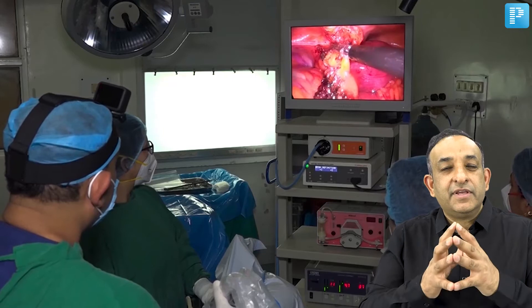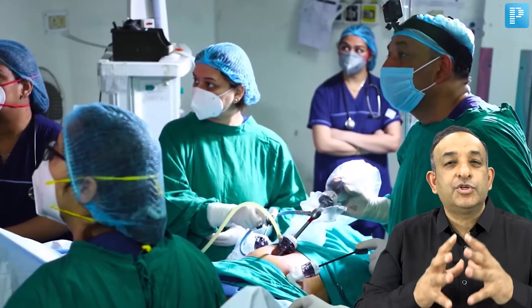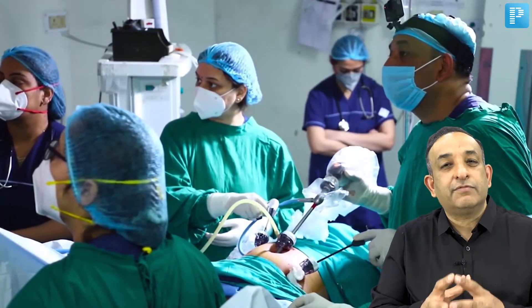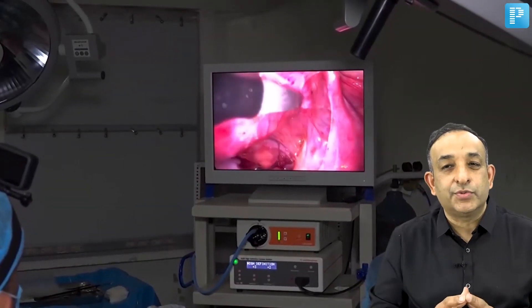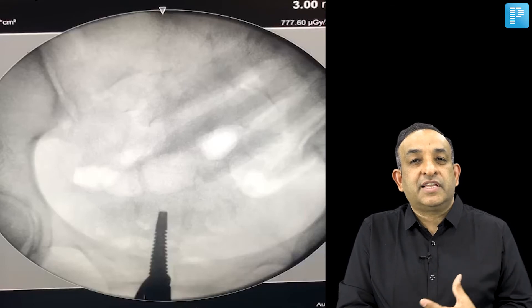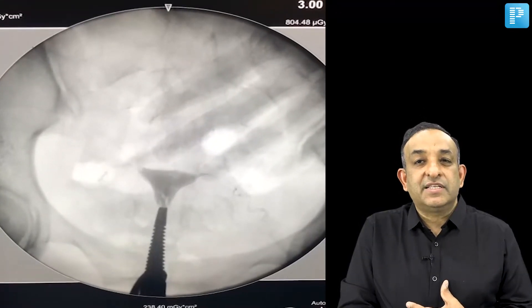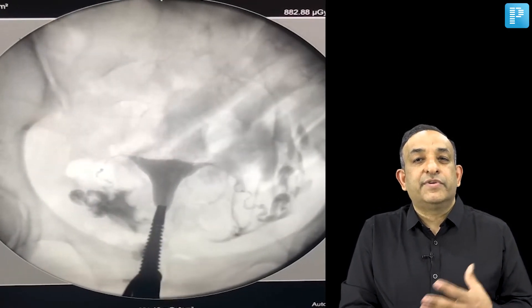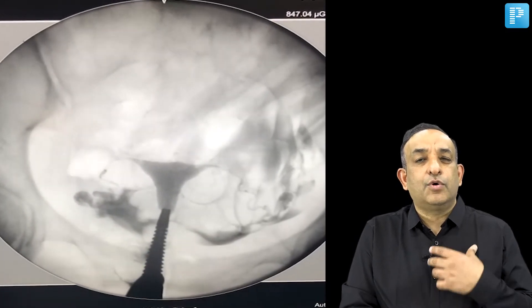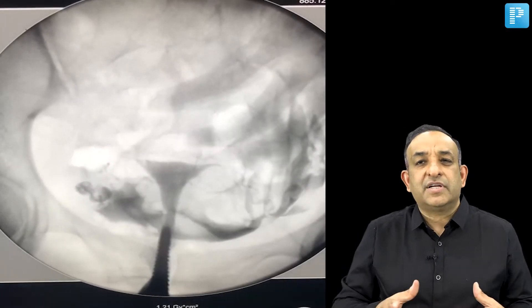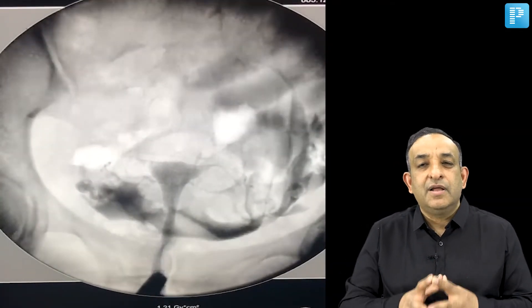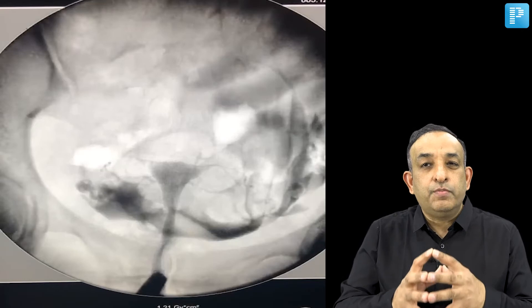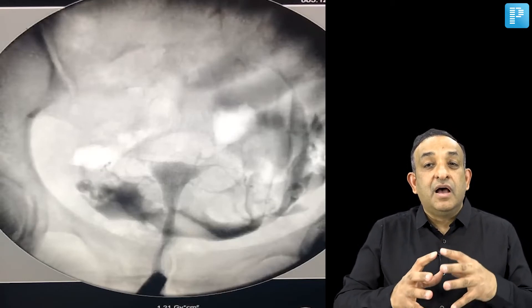If there are so many adhesions, the tubal function and tubal motility are compromised. That's why this woman was not conceiving despite the best ovulation induction regimes and intrauterine inseminations. Now, the HSG of this same case showed the uterus with perfect anatomy and both fallopian tubes appearing patent — left and right — leading one to believe IUI or ovulation induction with timed intercourse would be appropriate management.